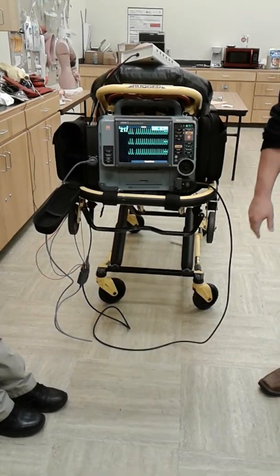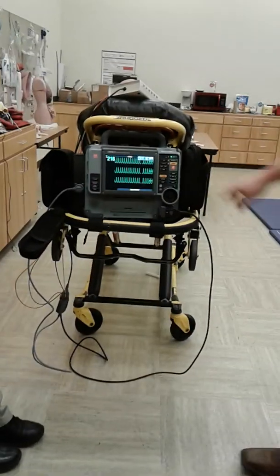All those are the same leads. I just got them lined up like that so everybody can see it. Kind of gets out of up there.